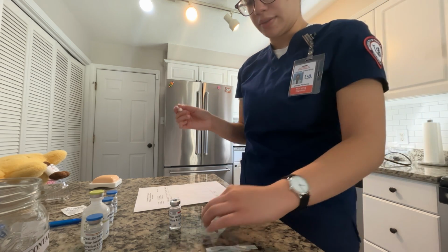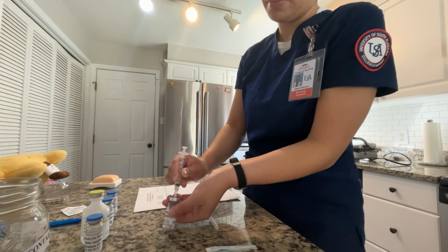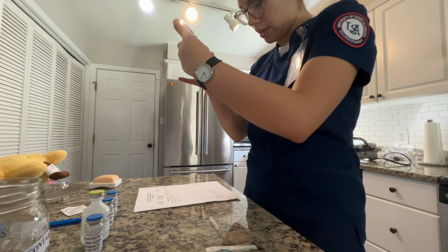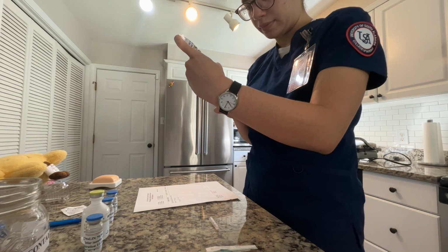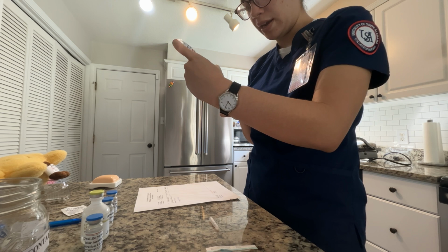So now I'm going to put this right here, and then I'm going to push that air into my vial, and I'm going to draw again 0.5 milliliters. I want to make sure I don't have any air bubbles.